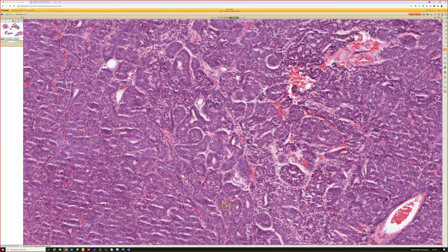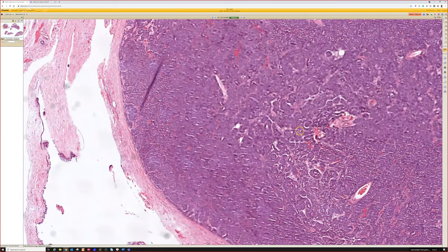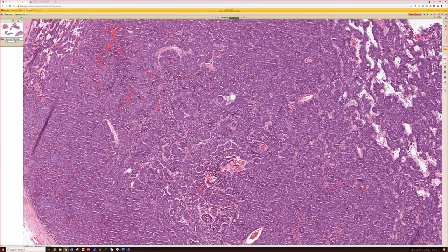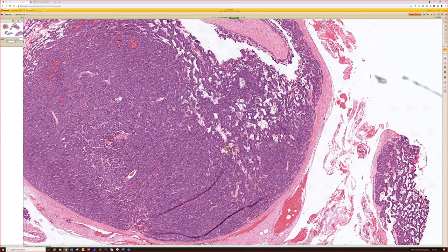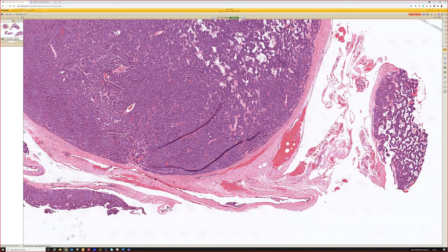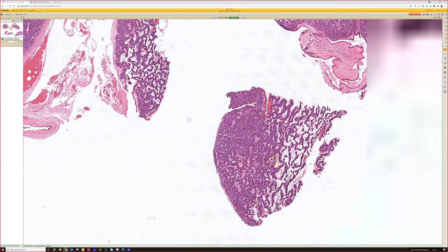Here's sweat ducts, these little holes and tubules, but they can sometimes be very focal. And again, this can have a lot of overlap with cylindroma. And so when you see a nodule where all of the nests are making a big sheet into a big nodule, then that's spiradenoma. When you see actual discrete nests that are molding together like the giraffe spots or the puzzle pieces, then that's cylindroma. But the distinction is of no importance. They are both basically two ends of a spectrum, if you ask me.